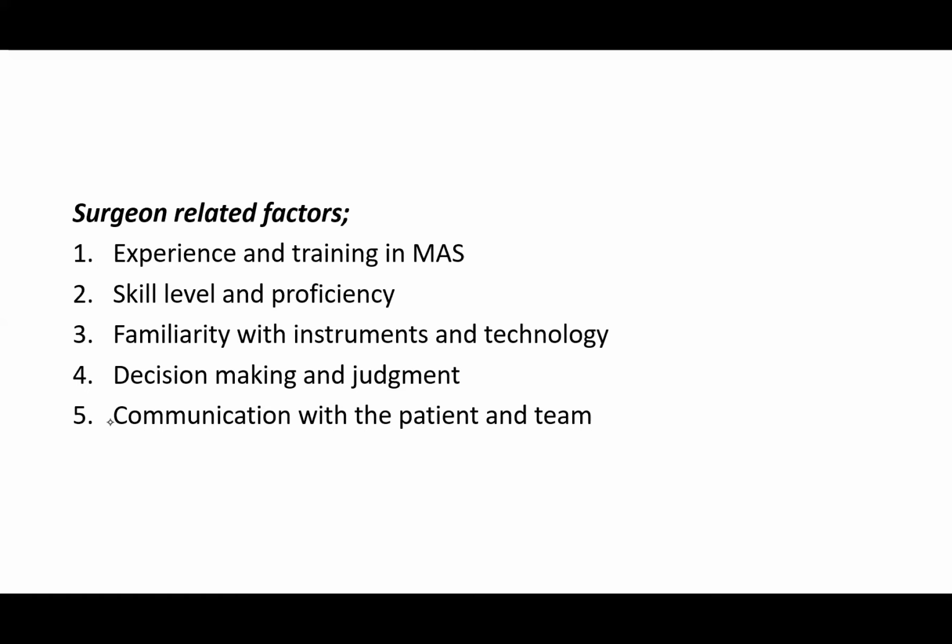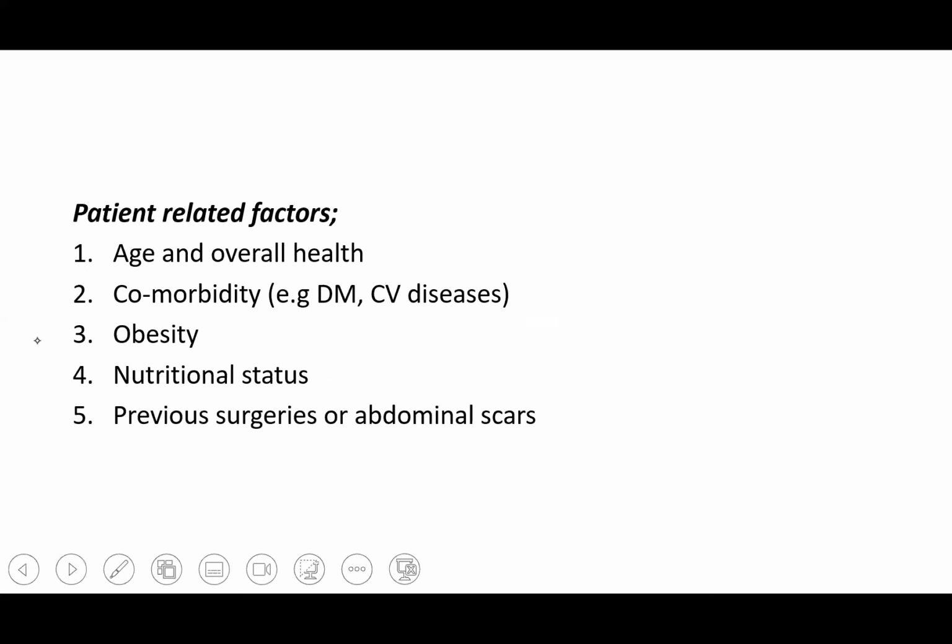So you have to make a decision, and this is highly influenced by your level of exposure and your background knowledge of the subject matter. So communication with the patient and team members. Now, it is very important you understand during this procedure, as I said, these processes are not a one-man show, it's teamwork.